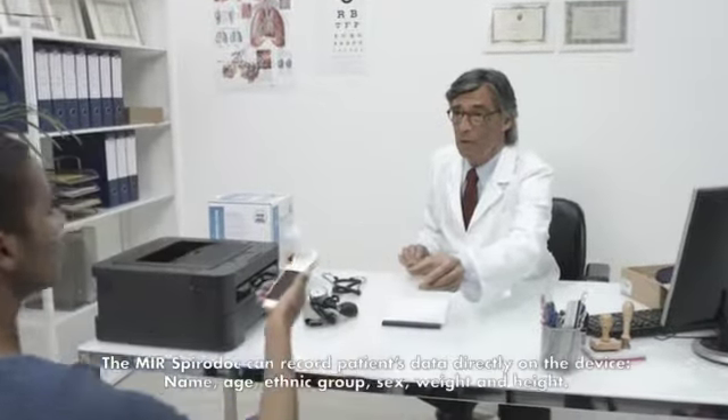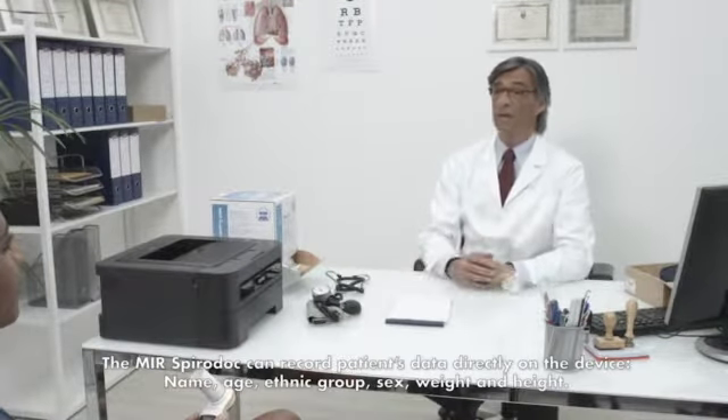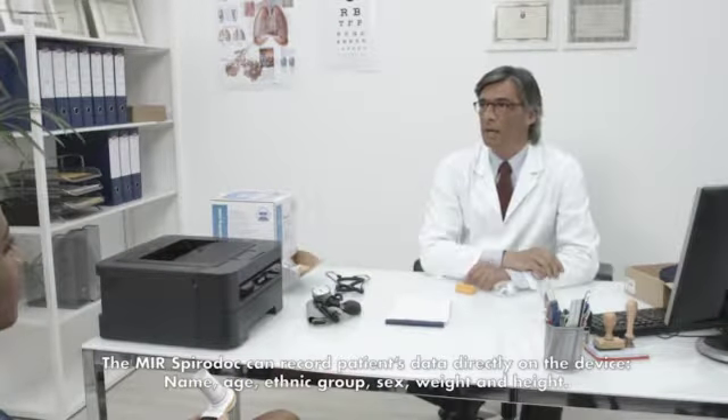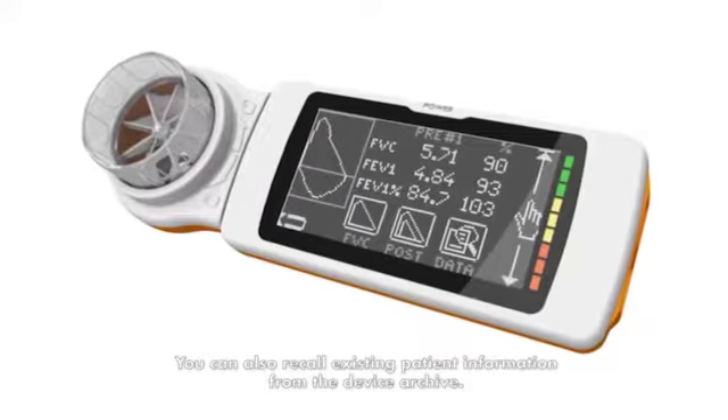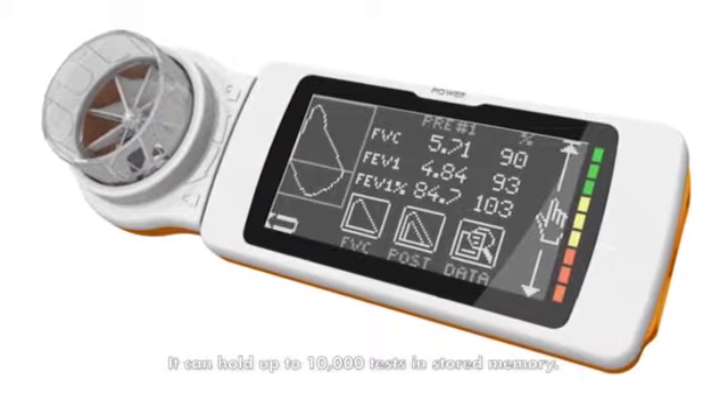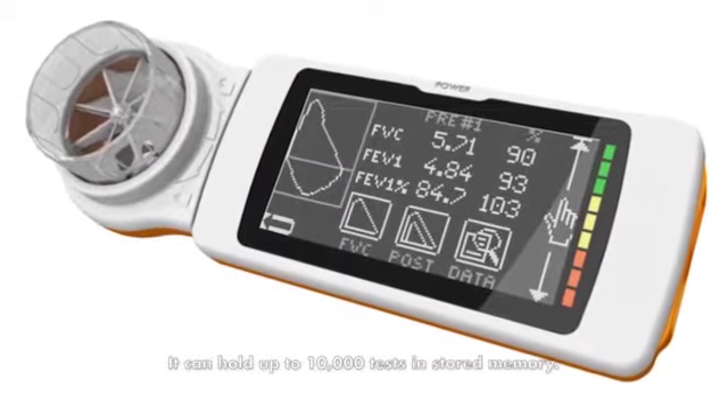The MIR SpiroDoc can record patient data directly on the device — name, age, ethnic group, sex, weight, and height. You can also recall existing patient information from the device archive, and it can hold up to 10,000 tests in stored memory.